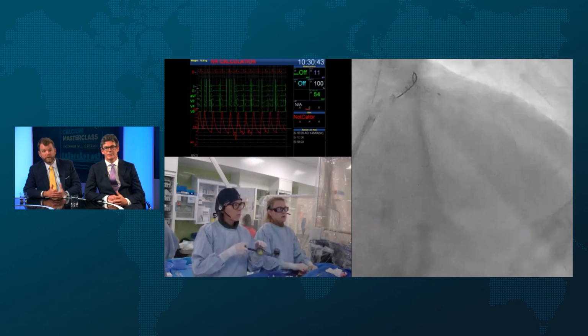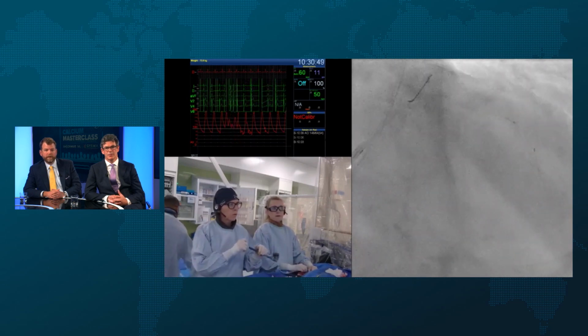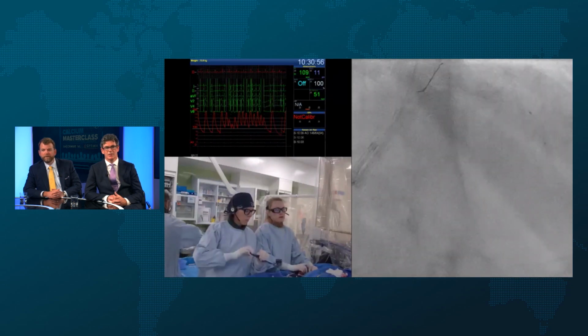I mean, it's actually quite difficult to do balloon-assisted microdissection with them because you get them up to 24 and you really have to work on them. But the small profile there, well done, that's actually quite nice. So, moot point. Okay, I think we're past that. Yeah, that tells you everything you need to know, really, isn't it?